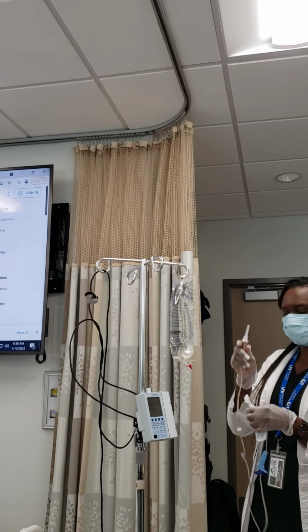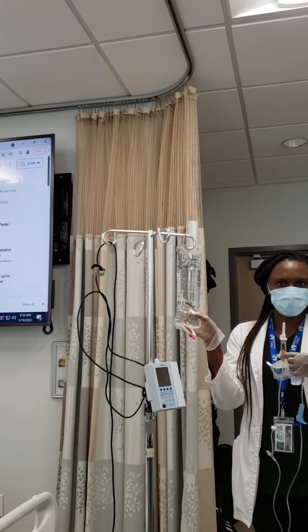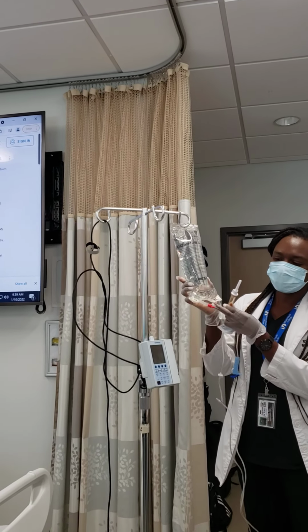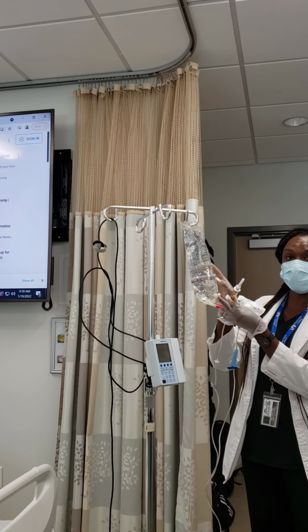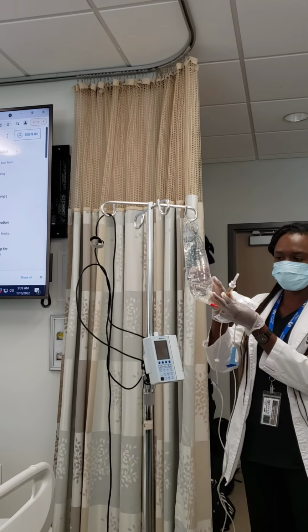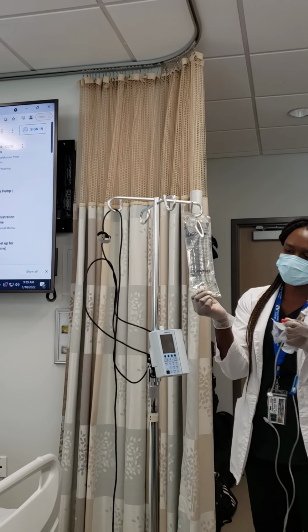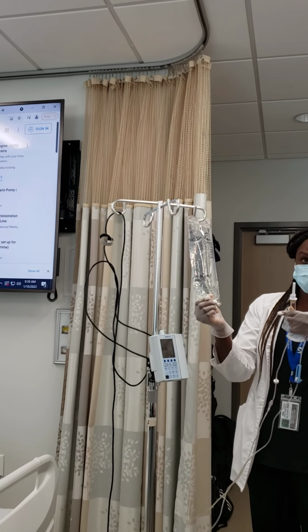Okay. So this gets connected to where? Where do you guys think? The red one. The red one, because there's always two. This is gonna be for medication. They use a needle-filled syringe to instill the medication inside. That's what pharmacy does. But the other one, I'll show you here. You just pull this out, and this is for you to spike it. All right.